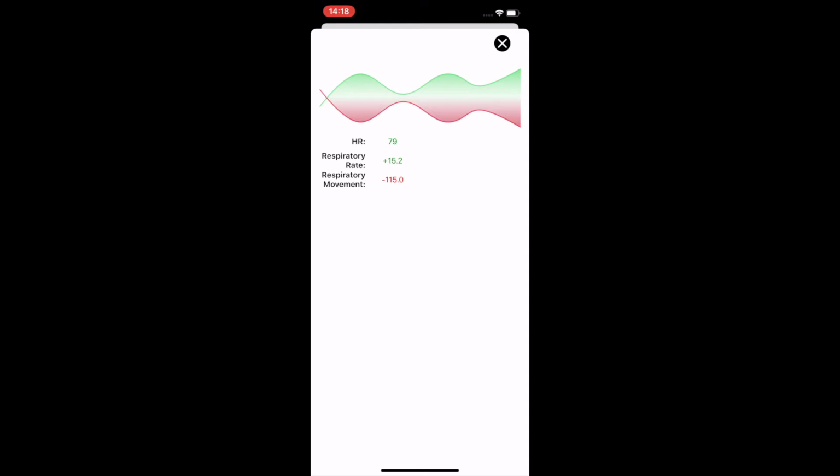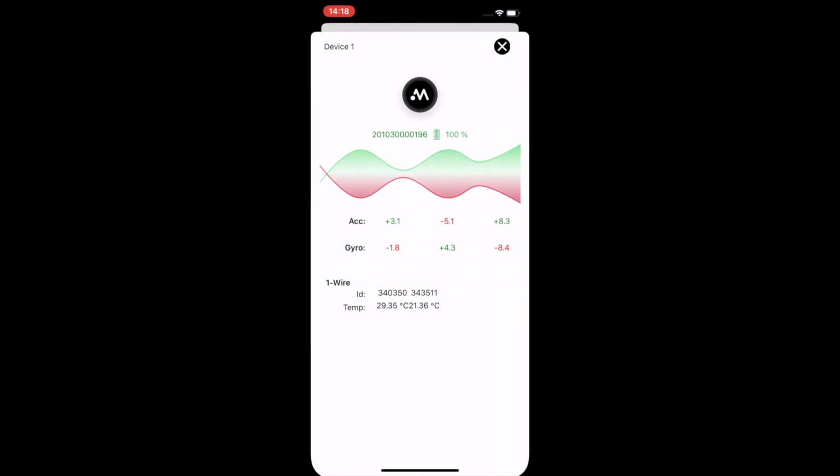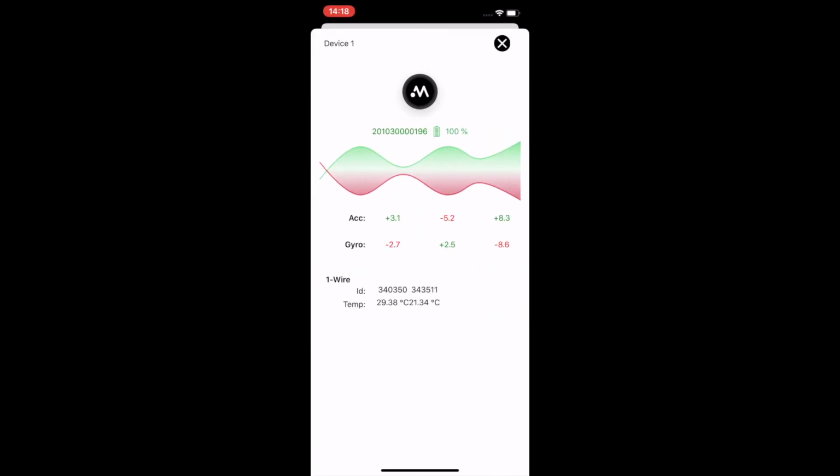So we have heart rate, respiratory rate, and respiratory movement at the moment. There's more upcoming as well, but this is now the first version. We added these 3 parameters to the Movesense data that we actually have. In addition to everything else, we have the standard Data Collector annotation features, so video, audio, and text, but we will not go into detail there.